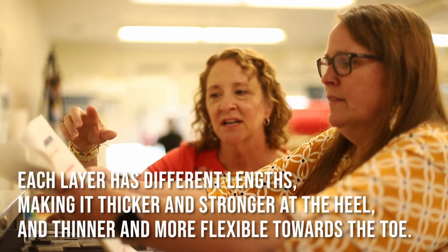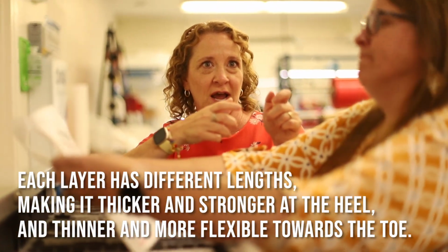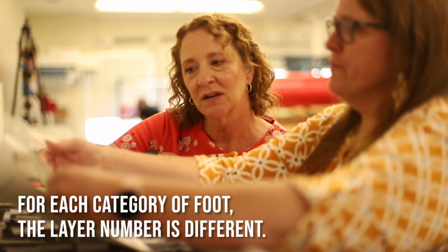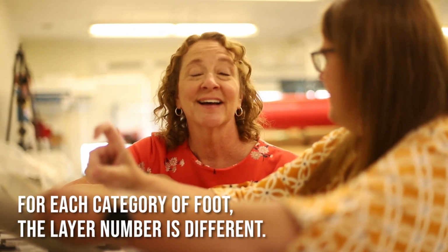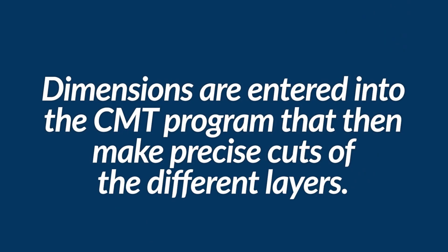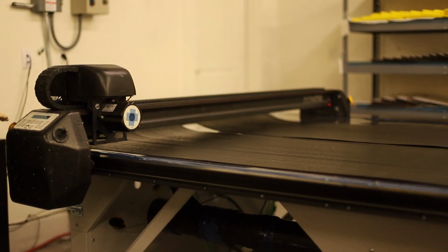And does that go back to how you're saying that it needs to be stronger at the pyramid and more flex at the toe? Yeah, exactly. And so for each category of foot, the layer number is different. And each size of foot, the number of layers is different. Yep, because it's optimized for that. Program it based on the design, and then they bring it in, and then it'll cut it to that length. And then they can just stack up the kit, and then it's in the right order and the right lengths for the layup.